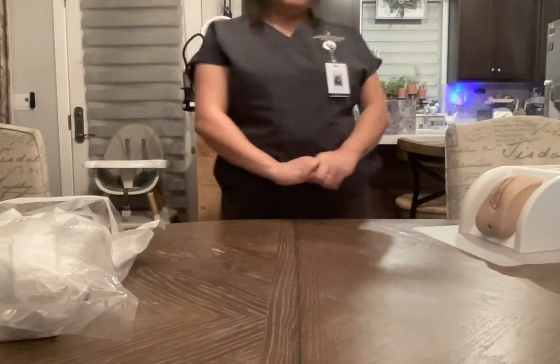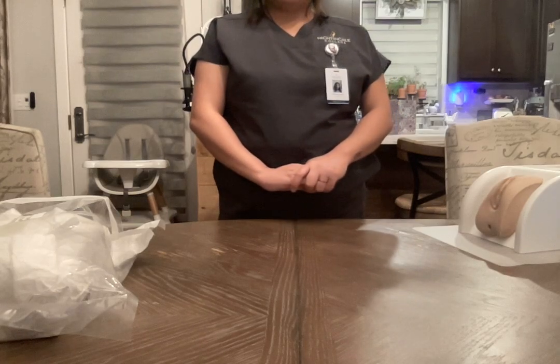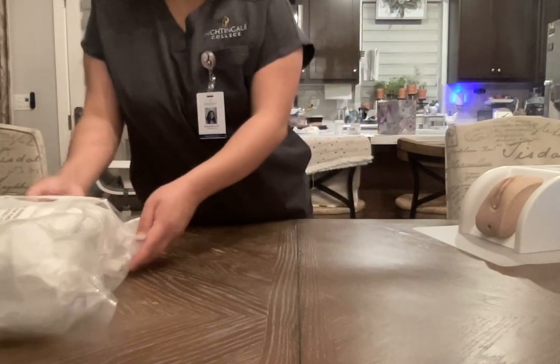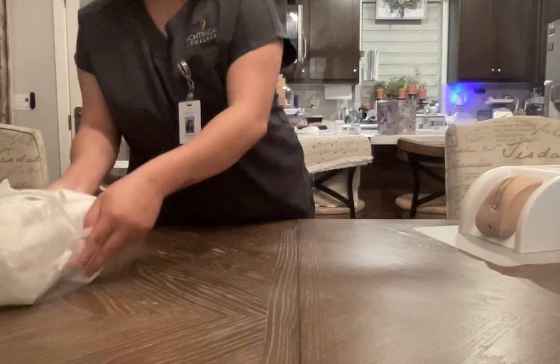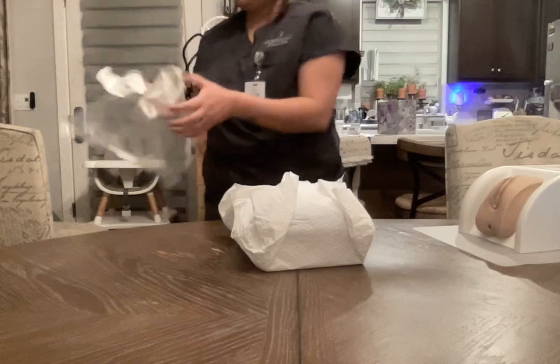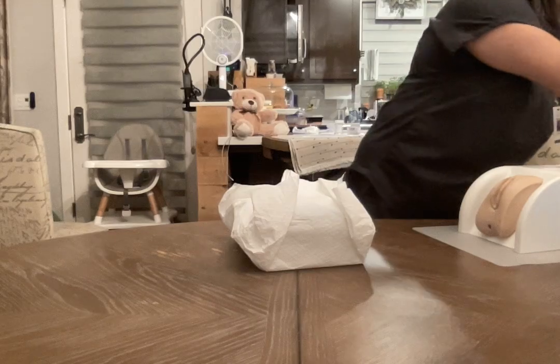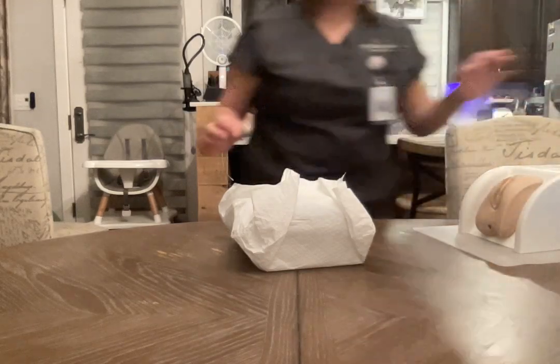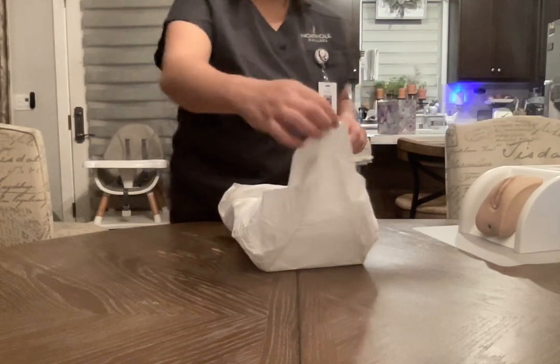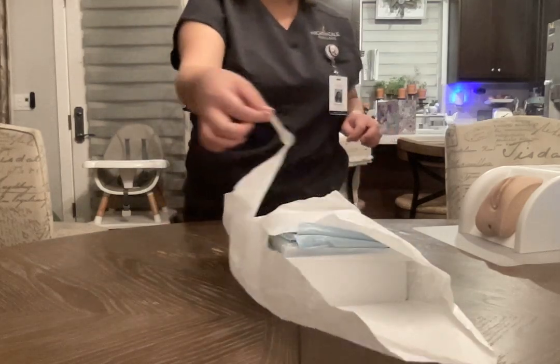And I'm going to put the bed at a comfortable working height. And I'm going to prepare the sterile supplies now and place it between the patient's legs. Okay, now I'm going to open the sterile field carefully, one flap at a time. Okay, making sure I don't touch anything inside the sterile field.